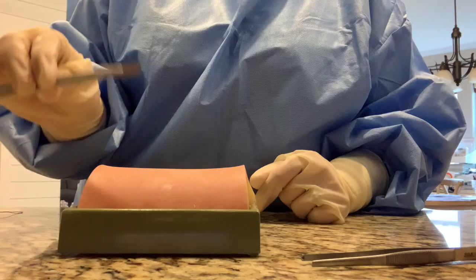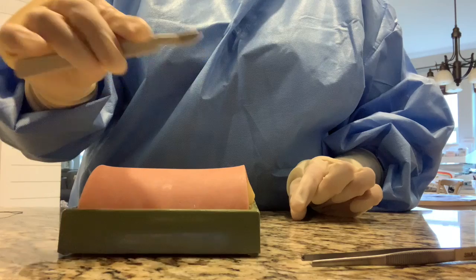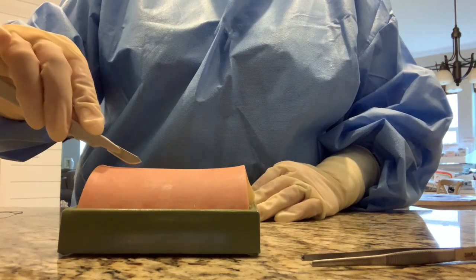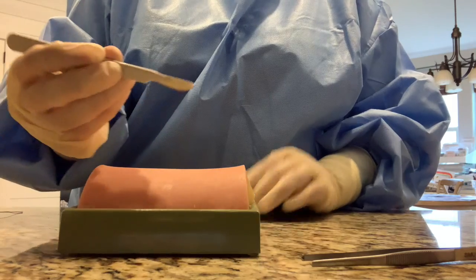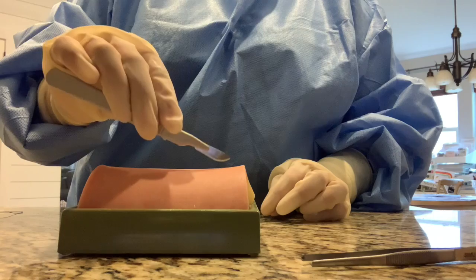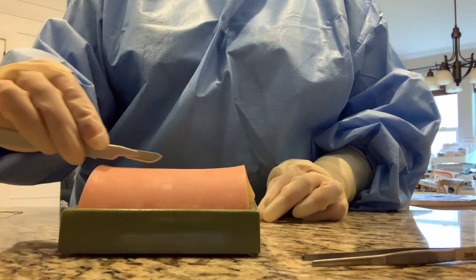The next thing we're going to talk about is the scalpel. You grab the scalpel like a violin, like so, so you can have nice, even, controlled pressure throughout. A common mistake is to grab it like this, because then you are only using the tip and not the whole blade. You use it like a violin handle so you can have nice, even pressure throughout with the whole blade.